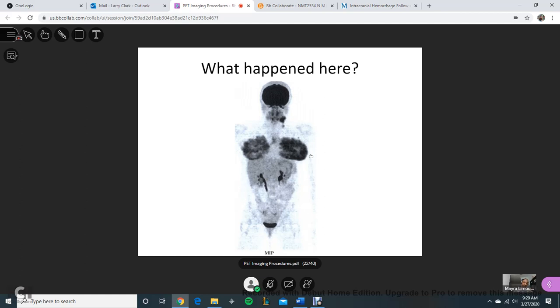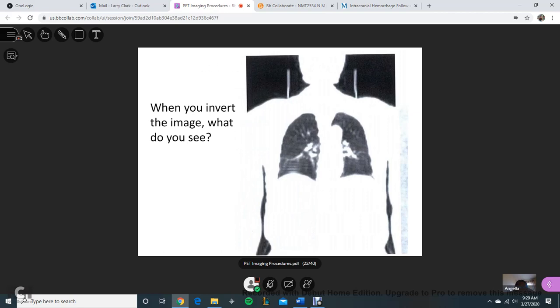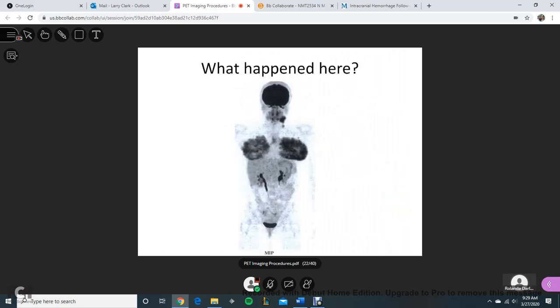So this is lactating breasts. Okay, this is what it looks like. Why does it have increased uptake? I'm glad that you asked that. First of all, your breasts are constantly stimulating because you are producing milk. So it's metabolically doing that by nature, and your lactating ducts are in constant working until they dry up.